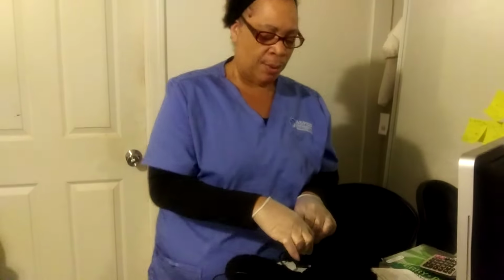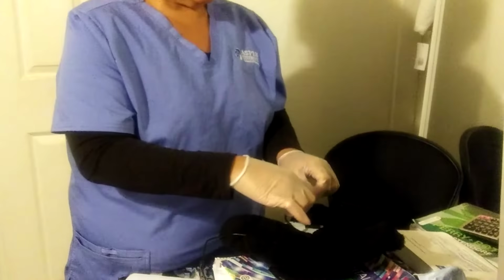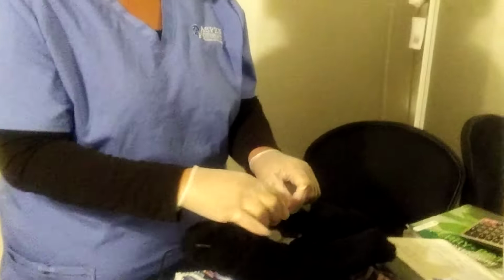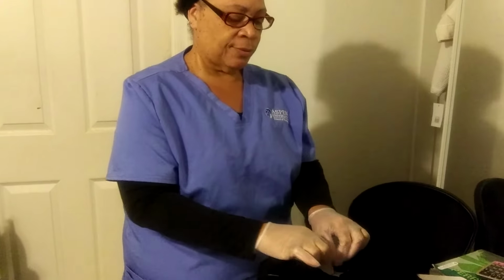So how I would do it, I would take it from the edges to pull it away from the tubing site. So I pull it back, loosen it very gently, or I can get an alcohol wipe to go around the edges so that I can loosen it up to make it easier to come off the skin. So I'm using an alcohol wipe and I'm rubbing it to get it off.